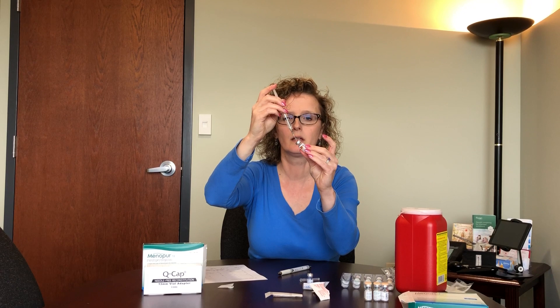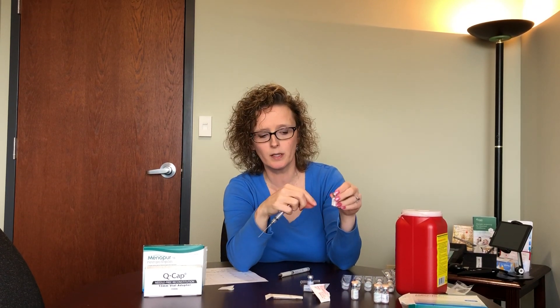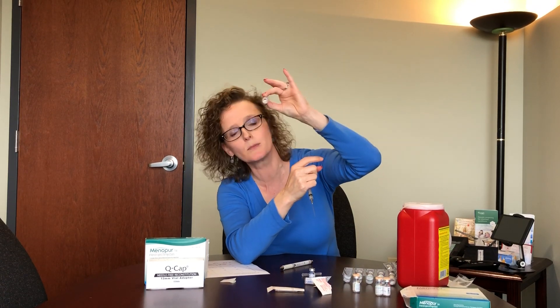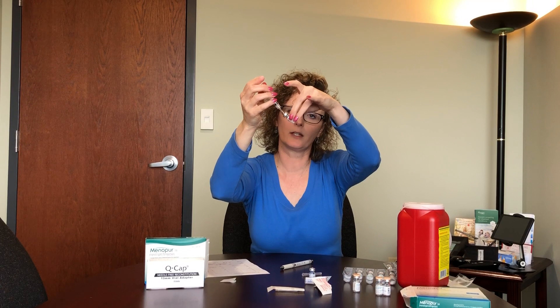Push the saline in about halfway down into the vial, then check to make sure it has gone clear. The powder is white in the bottom, but the saline is a clear liquid — you want the medication to dissipate into the liquid before you pull it back out. Look through the little hole or at the bottom of the vial to make sure it's clear before drawing it out.